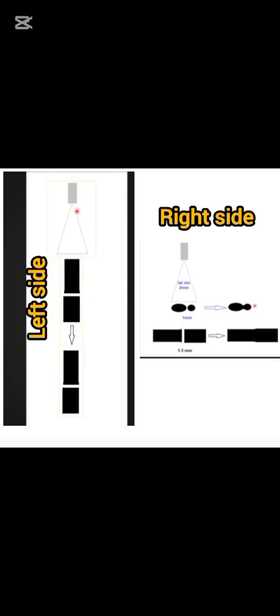In this schematic image, the right side is the lateral resolution and the left side is the axial resolution. The axial resolution in a good machine is 1 mm and the defect size is more than 1 mm, so it shows the two particles separately from one another.